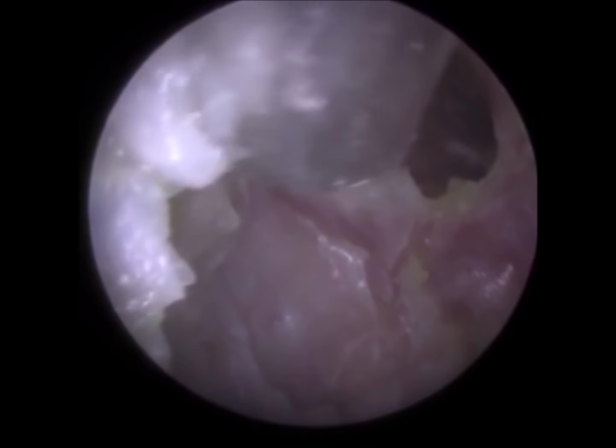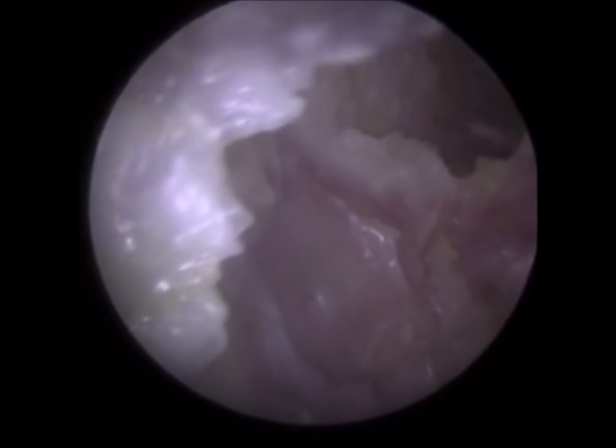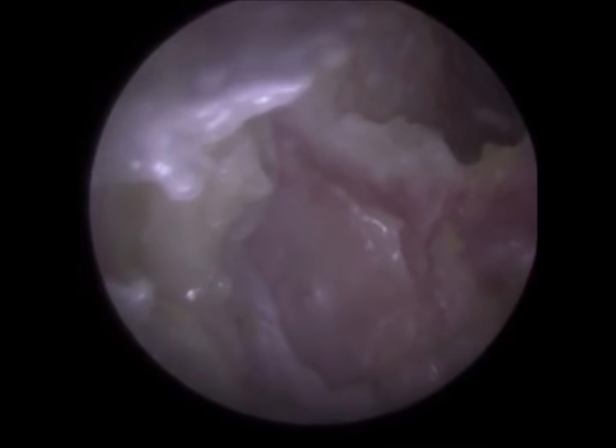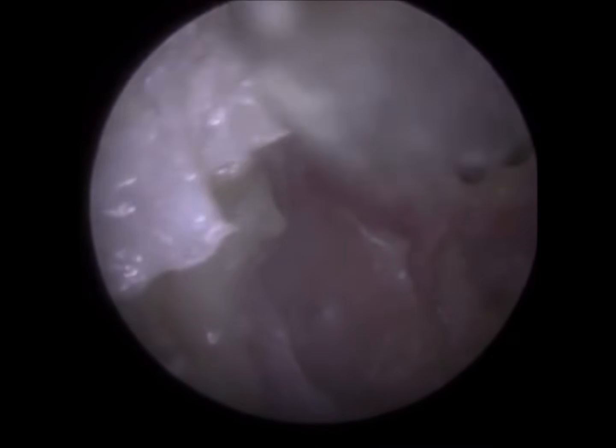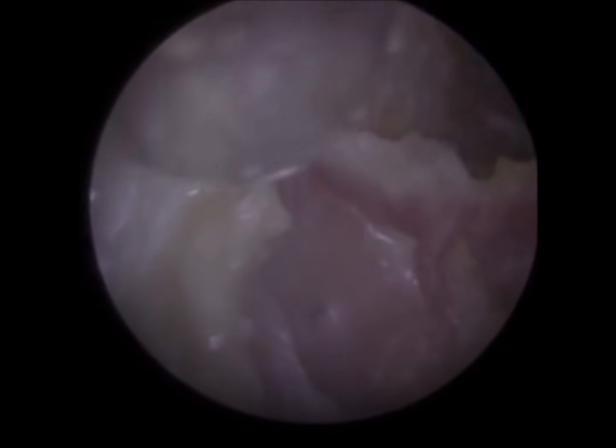So that's the rim of his original ear canal where I was just before, and at the bottom you can see just a huge cave. And although symptoms were alleviated, the patient's still experiencing a lot of pain, a lot of otalgia, and this skin is such a heavy, dense layer of skin, and we really have to peel this, putting a lot of pressure.